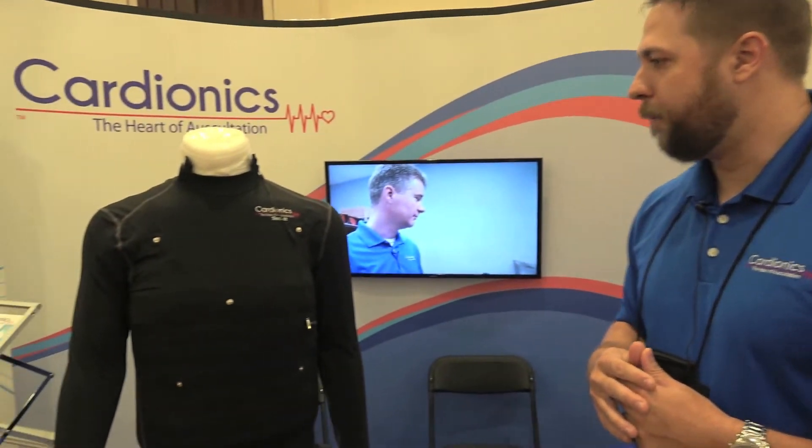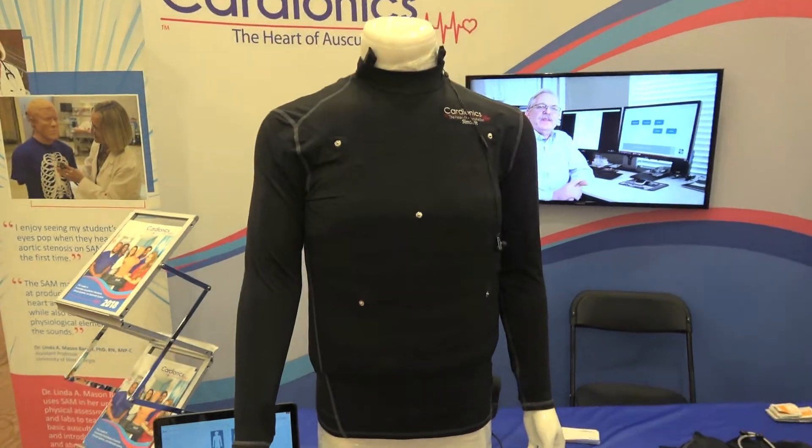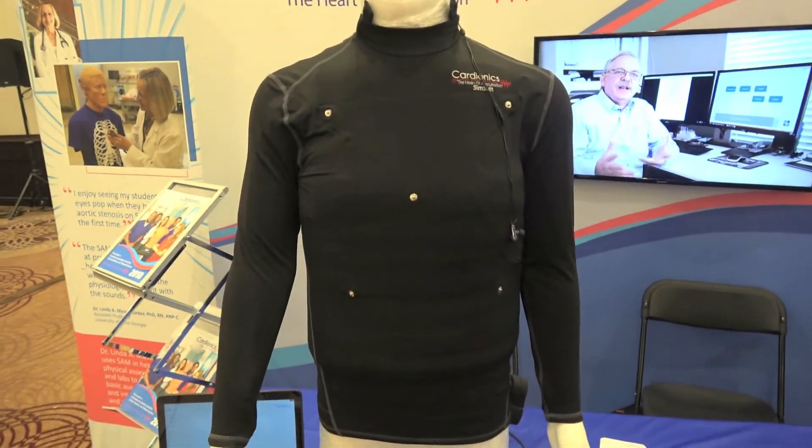That power pack also has a Wi-Fi hotspot, so it's essentially a networked system so that you don't have to go through the school's or institution's internet firewall. That's really the gist of the SimSuit, and it's great for any program with standardized patients as well.